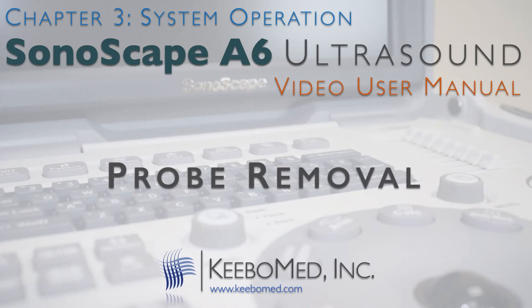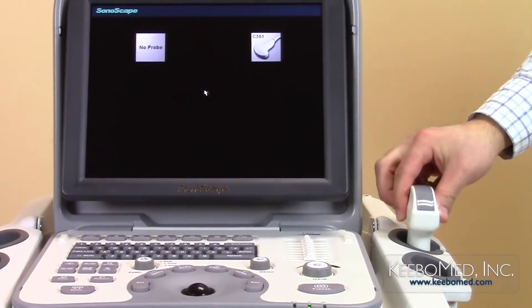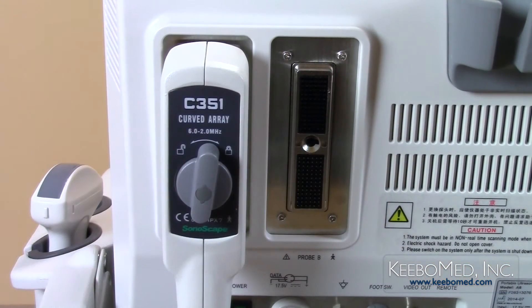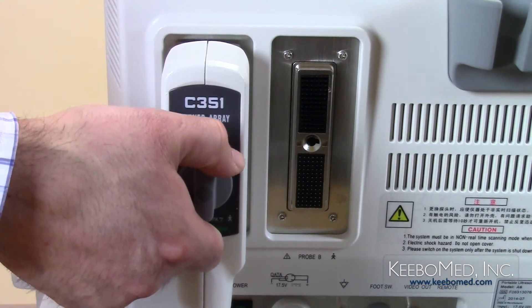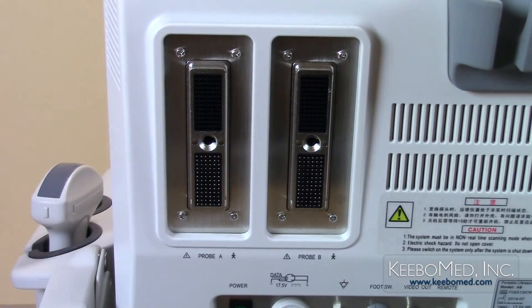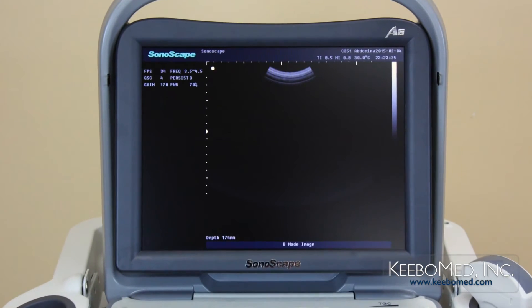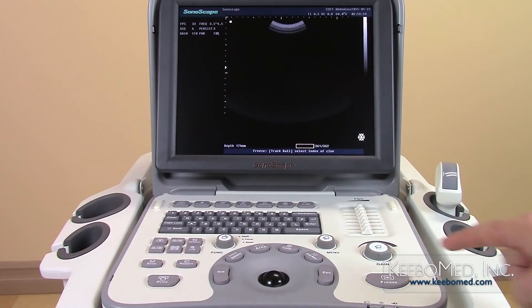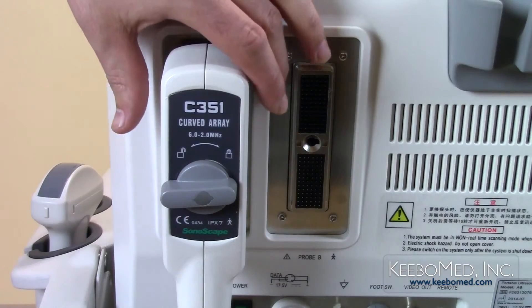To remove the probe, follow these simple steps. Step 1: Put the probe head safely inside the probe holder. Step 2: Turn the lock knob counterclockwise to the unlocked position, and then remove the probe carefully from the probe socket. Probes can also be connected or disconnected from the ultrasound while in exam mode. Freeze the image first using the freeze key on the keyboard. Now the probe can be safely connected or disconnected.